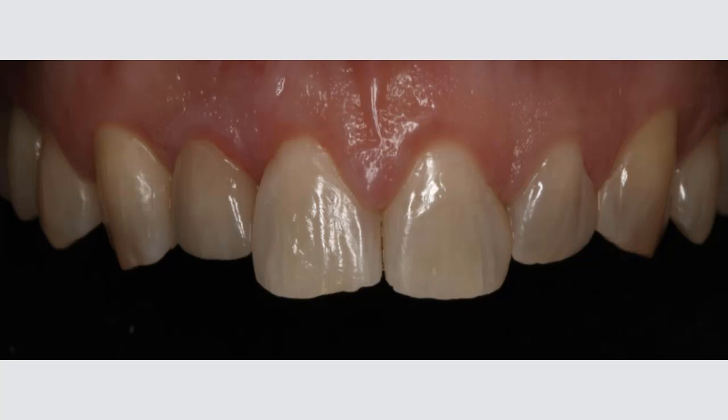It's the date of cementation. You still have some information still from the cementation that we have provided after the polishing, which looks okay, could be much better than that.